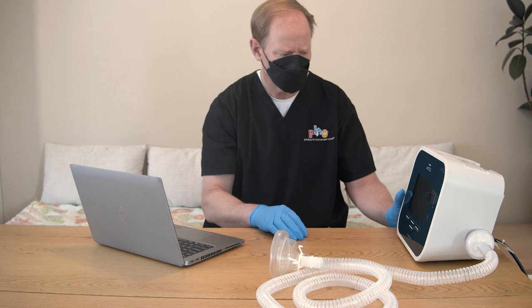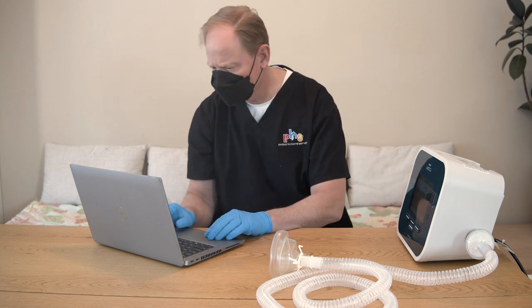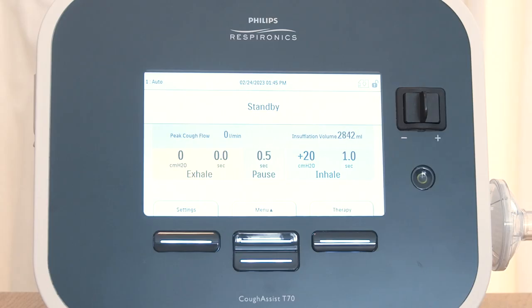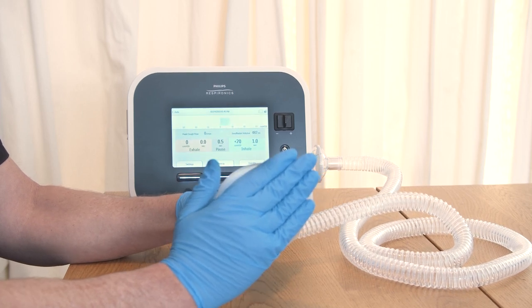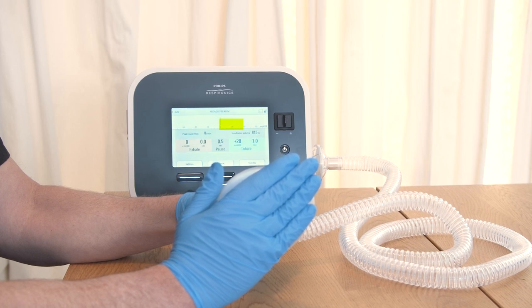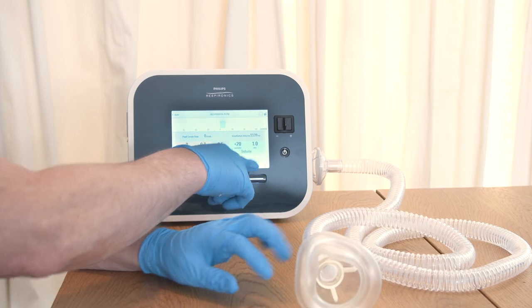Turn on the cough assist device. Check that the settings on the device match those prescribed by the healthcare provider. When breath stacking, only a positive inhalation pressure is set. To check if the device is working, press the therapy or start button and block the end of the tubing or cover the mask with your hand. You should see only positive pressures on the display screen. Once you see positive pressure breaths, the check is complete.